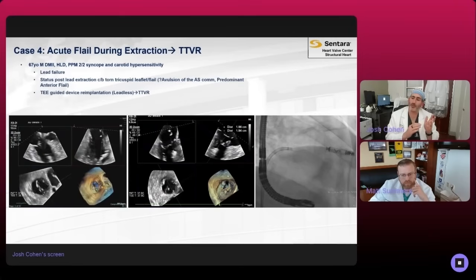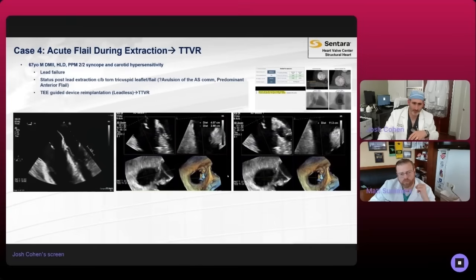I think what companies will tell you is you have to be above 1.8 or so. They'd like you above 2 for margin of error, and we were about 2 after multiple attempts. Sometimes we try and go up towards the RVOT. I wouldn't speak as an EP, but I think sometimes that's a less good place for them to place it, but maybe more fitting on the valve side. But we ended up getting about 2 centimeters from the annulus, and so we felt good about that.